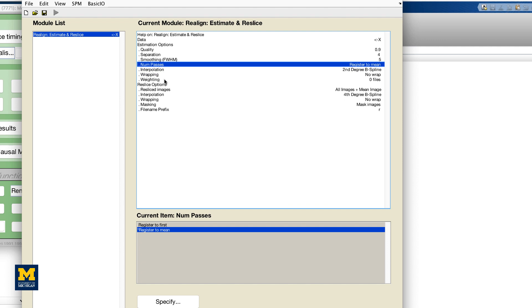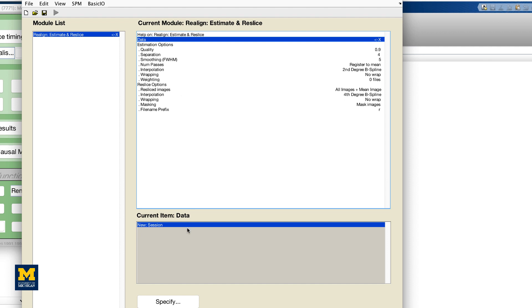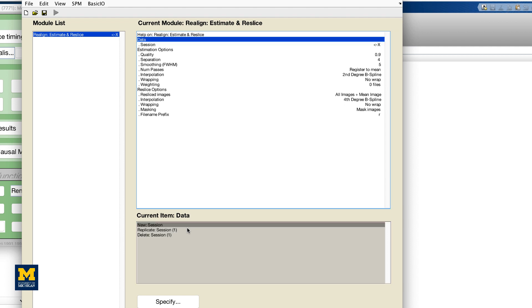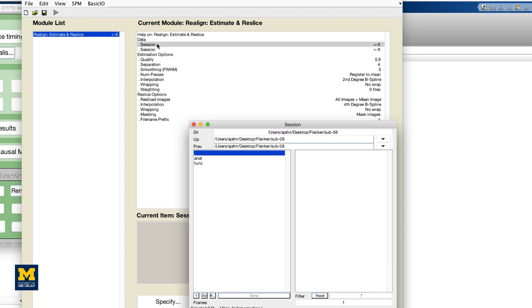In this experiment, for each subject, there were two runs or sessions of data. If you click on the Data field, you will see an option to add more sessions. Click on New Session to add another session. You will see an X to the right of each session field, indicating that this field needs to be filled in before the program can be run. Add another session, and then double-click on the first session to open up the image selection window by double-clicking on Session.